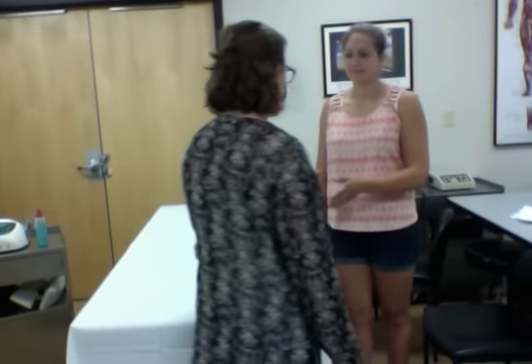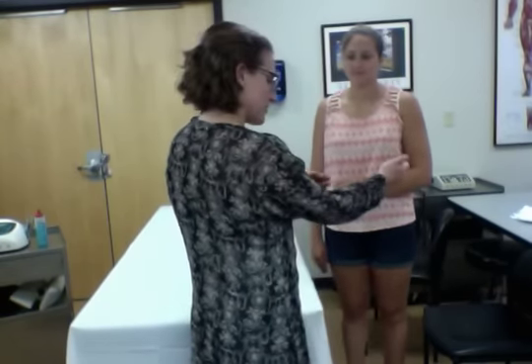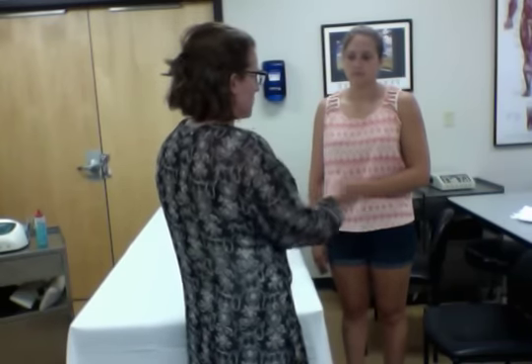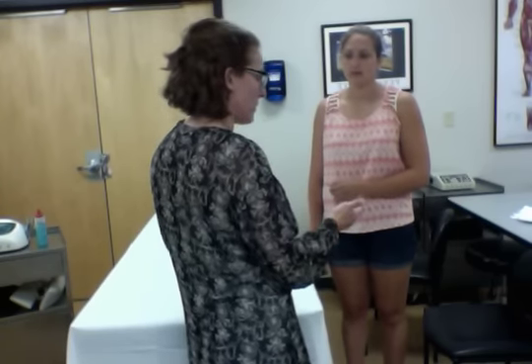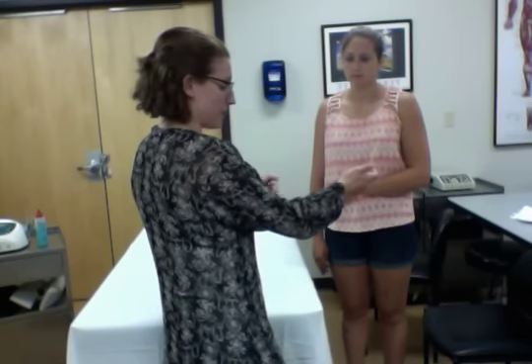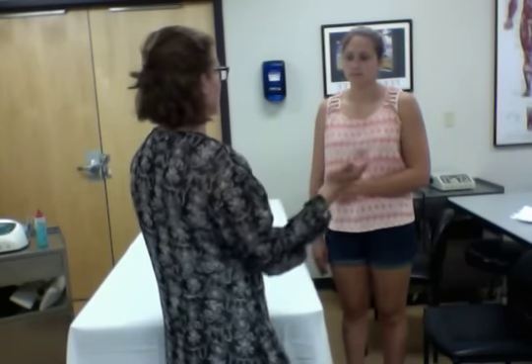Hi, JC, I'm Dr. Wilbanks. I'm going to be your student physical therapist today. And since you're having some difficulty extending your elbow all the way, I think it's because there's some shortened tissue on the front of your elbow from being like this for so long. So we're going to use ultrasound today. What ultrasound does is it makes sound waves, and those waves turn into energy when they go into your skin. It helps to warm that tissue up. And when it's nice and warmed up, then it's a little more flexible. So you're going to find it able to extend a little more.